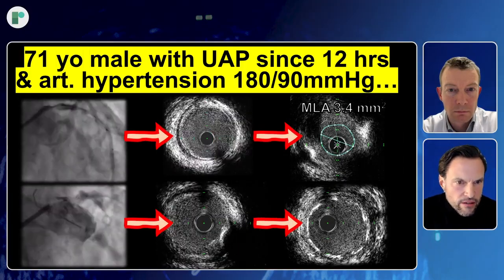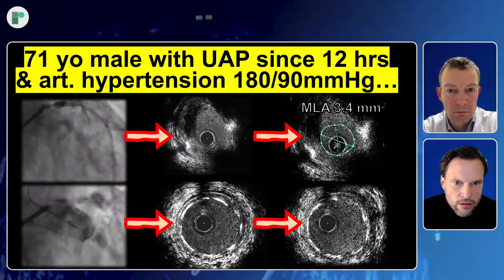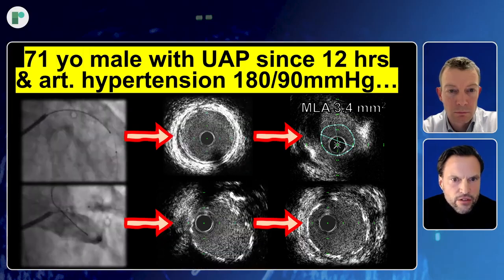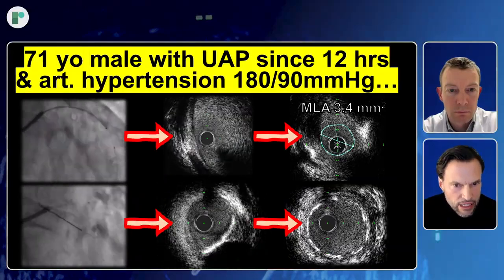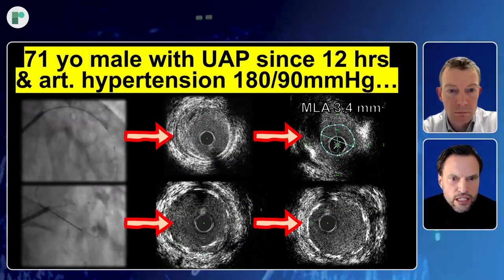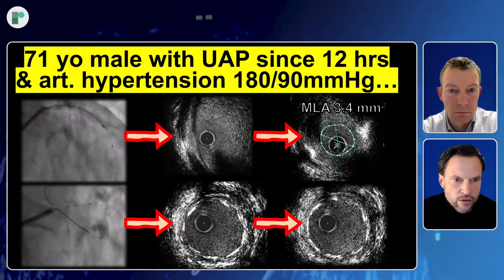And yes, it's important to have the information from IVUS, not only to define the severity of the coronary artery disease or the stenosis, but also to plan the procedure, to size your stents, maybe to upsize your stents, to think about bailout strategies, for example, to appreciate the amount of calcium and so on, and then you can have a good result.